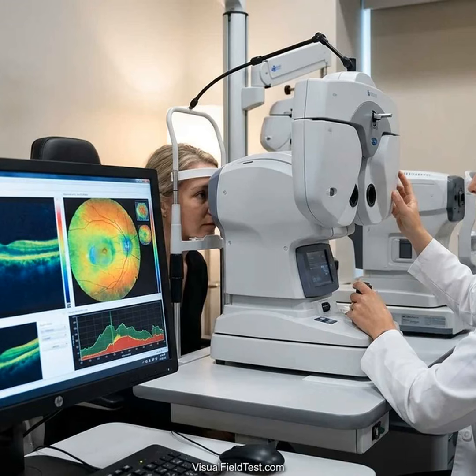However, in moderate glaucoma, it is also true that test variability is higher, so often an OCT result is repeated quickly to confirm. If there's any doubt, more frequent monitoring or additional strategies, like 10-2 visual fields focusing on the center, may be used. OCT in advanced and end-stage glaucoma.